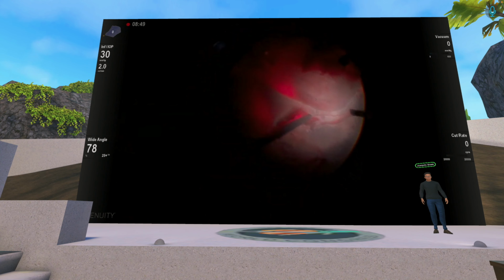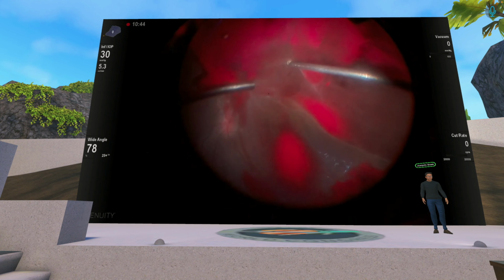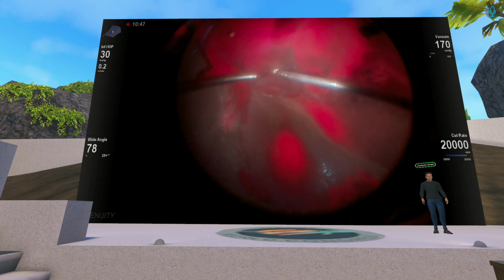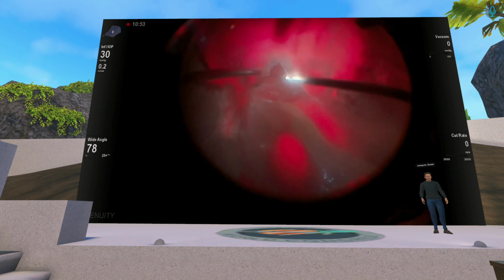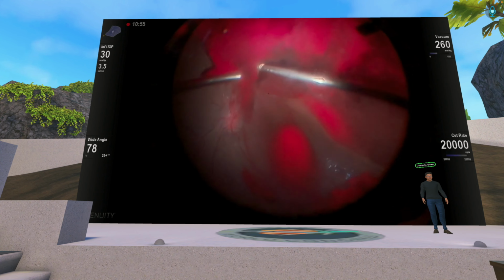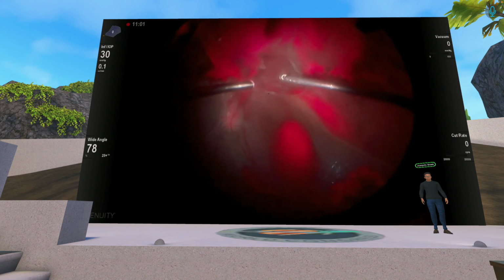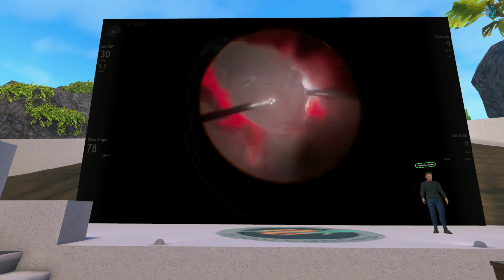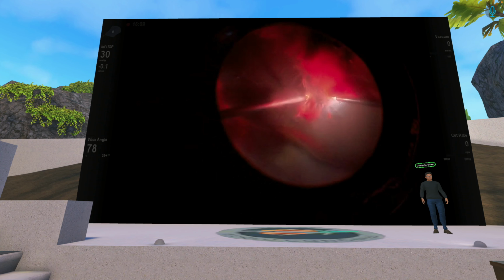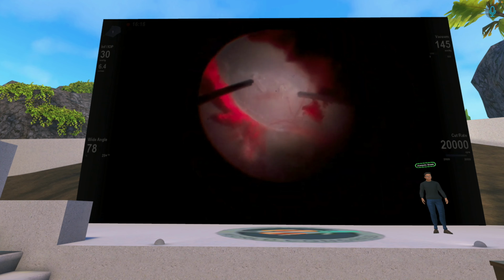This was a baby that we were following up with ROP that got lost and returned two years later with a total retinal detachment in the other eye, and this eye with a vitreous hemorrhage. There was this very thick membrane. We were not sure in the moment if it was hyaloid, if it was retina. As you can see, there's a very big bridging vessel between that thick membrane and the surface of the retina.